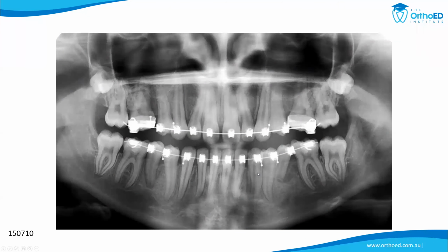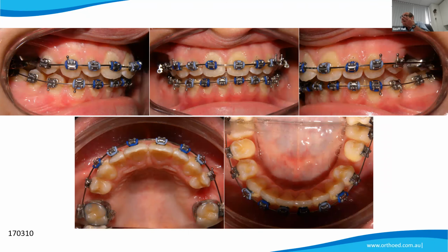Okay. So do you shift the bracket on the 3-5? Yep. Well, but before I do that, I'm going to check clinically. Is it exactly? Yeah, because that's what it looks like on the OPG. Remember, back then we didn't have cone beams, and the more I've been doing orthodontics, the more I'm saying to myself, I don't believe that the OPG is that accurate for root positioning, and I'll show you in a second. Phillips asked the question, was a power chain used to close the upper 5 space from upper 6 to 6? Yes, it was at the time.